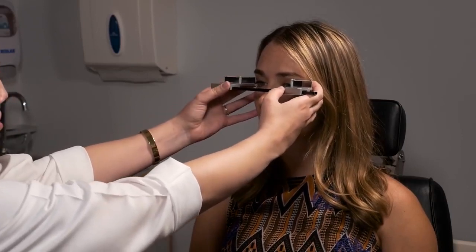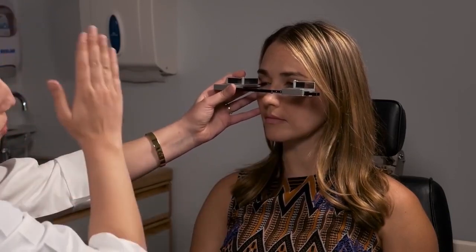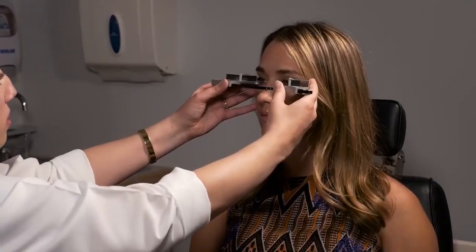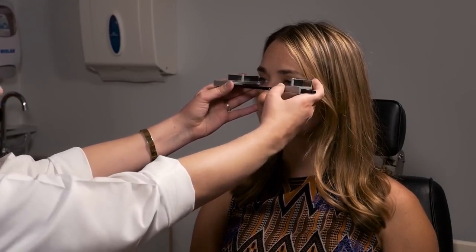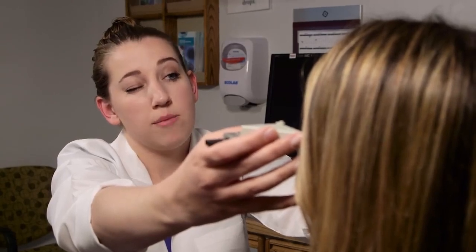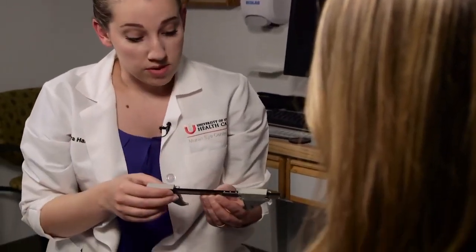So while the patient is positioned that way, you close one eye, look in the mirror, and you'll see two red lines. The point of the red lines are to eliminate parallax. So you line those two up when you're taking the measurement. You look in the mirror, and you can see the corneal apex. And so you just use one eye open, ask the patient to look at your open eye, and you mark in your head where the corneal apex falls. You do the same thing on the other side, and you always want to make sure that you take the base measurement. This is the distance between the two index points.